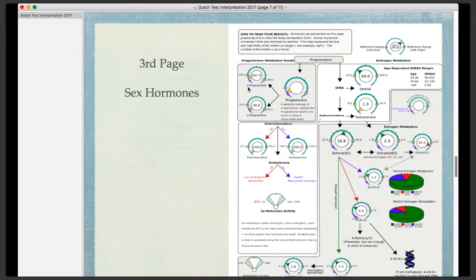So kind of the combination of how you feel and what the actual level is will show up. If you're taking it orally, it will show up here. So it just kind of depends. You can see that hers is in the semi-low normal range, slightly above menopausal range. And then DHEA, normal is 23 to 350, and there's the range of normal again. And so it's on the low normal side.